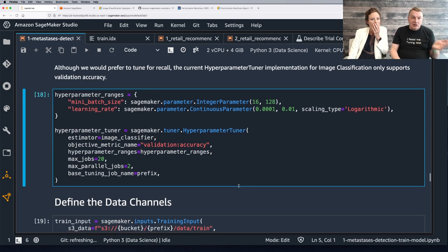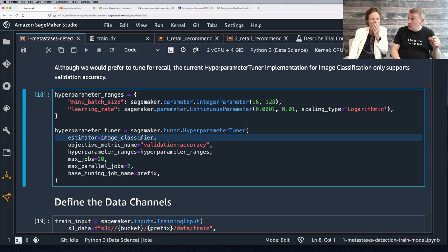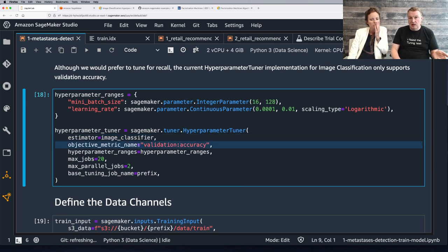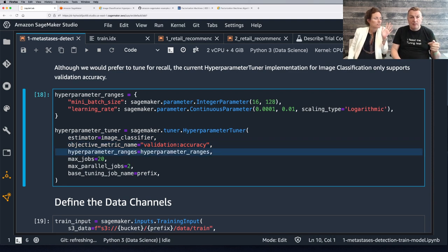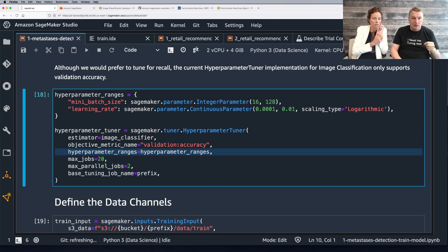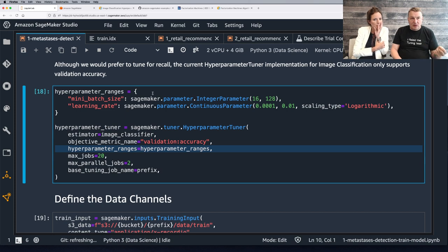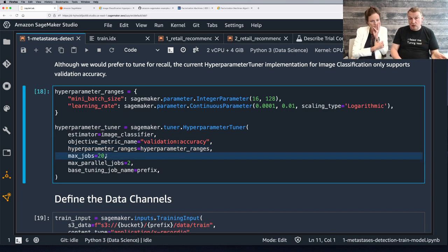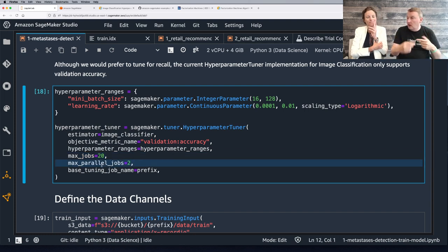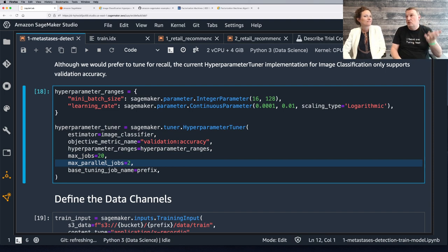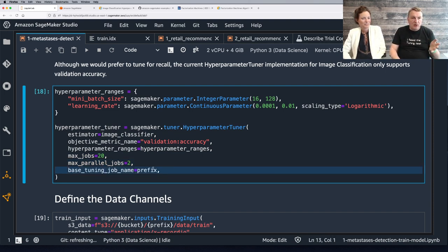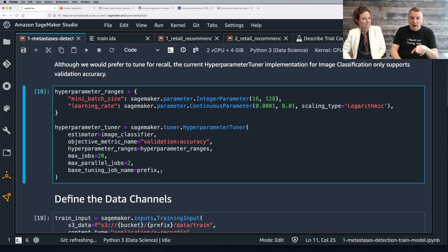I can specify that the learning rate should be explored using a logarithmic scale, because I'm not really interested in trying 0.0002 — I want to try the different orders of magnitude. Then we define the tuner where we pass the estimator, the metric we want to optimize for — validation accuracy — the parameter ranges, how many jobs to run (20 here), and we run them two by two to speed things up. A prefix for the base name for the tuning jobs.